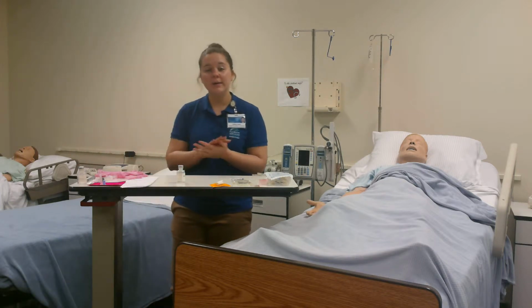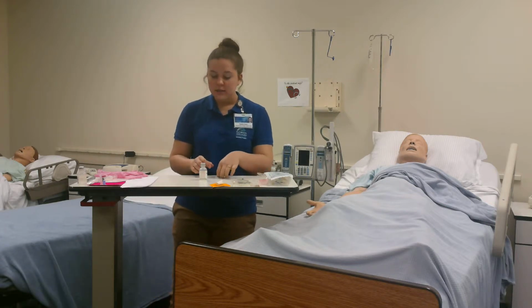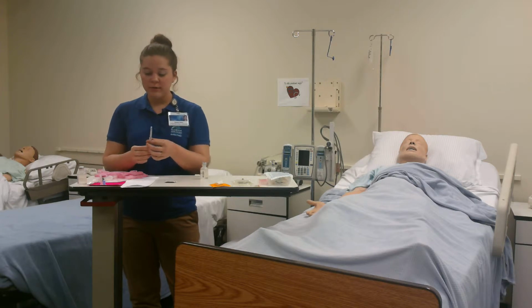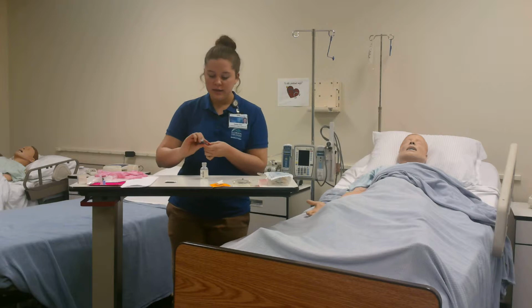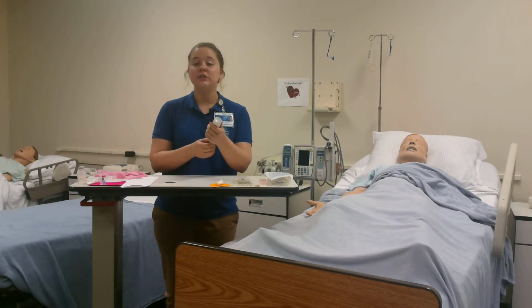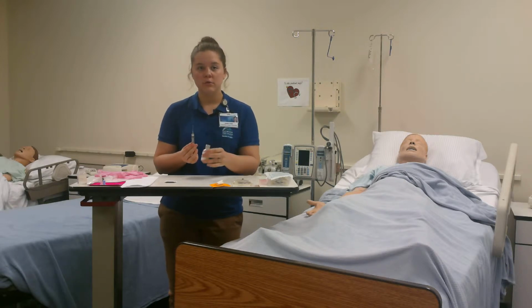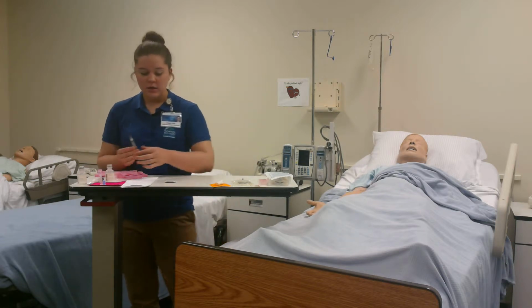Okay, I'm going to perform hand hygiene, and I'm going to perform proper aseptic techniques. So I'm going to clean my vial, and I'm going to draw 1 milliliter of air, and I'm going to inject the air into the vial. Okay, and I'm going to draw back 1 milliliter of vancomycin. Okay, and we will continue.